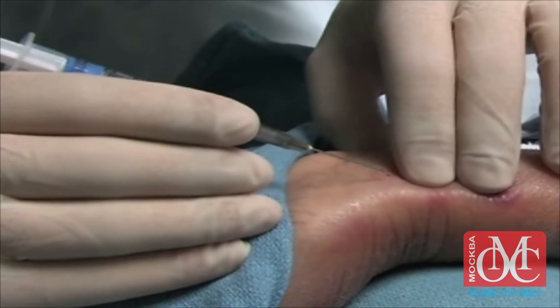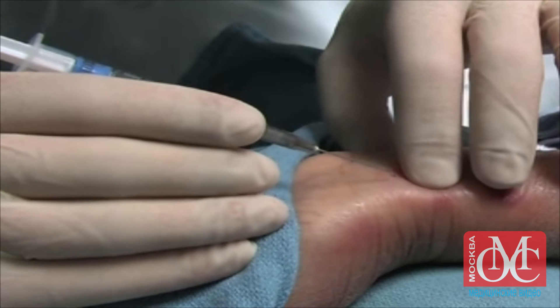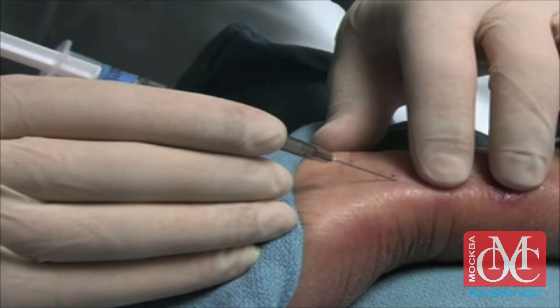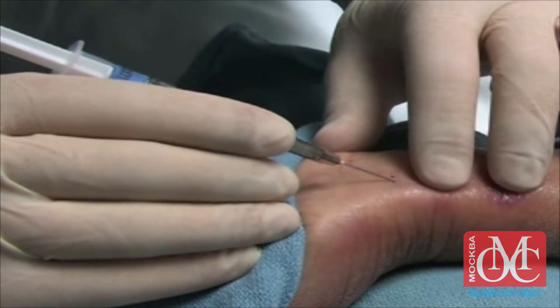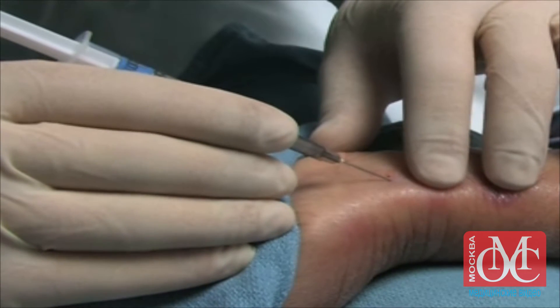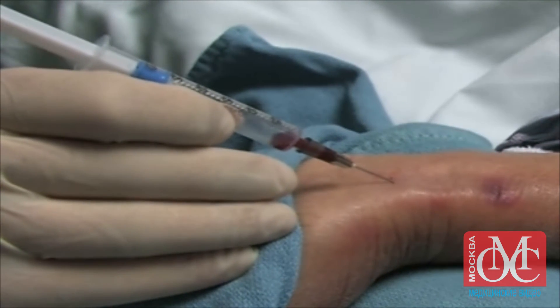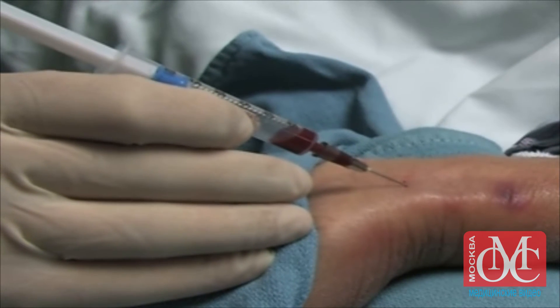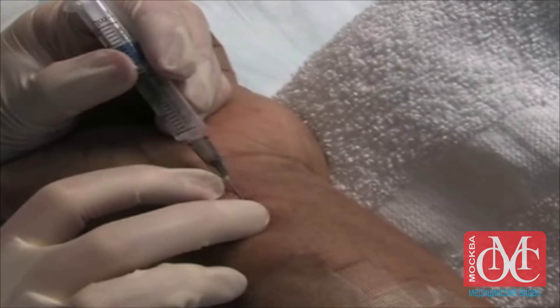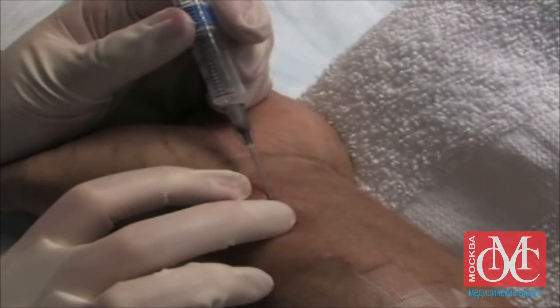Again, locate the maximum impulse with the index and middle fingers of the non-dominant hand. Holding the arterial blood gas syringe with the dominant hand, aim the needle away from the hand and toward the upper arm and puncture the skin at a 30 to 45 degree angle at a point just below the index and middle fingers of the non-dominant hand. Advance the needle slowly until the syringe easily and passively fills with bright red pulsating blood. Ideally, you should obtain at least 1 to 2 cc's of blood. If no blood is obtained, do not pull back on the plunger. Withdraw the needle slowly until it is just under the skin and re-attempt the procedure.